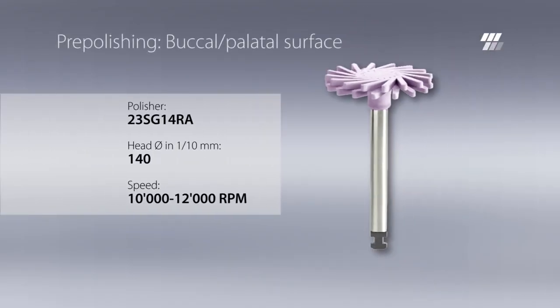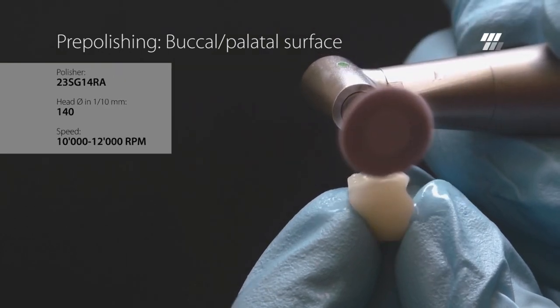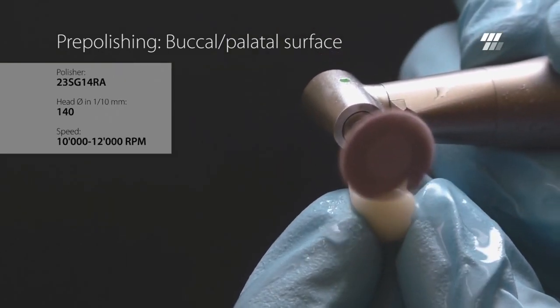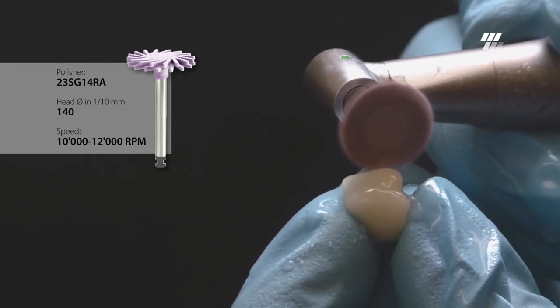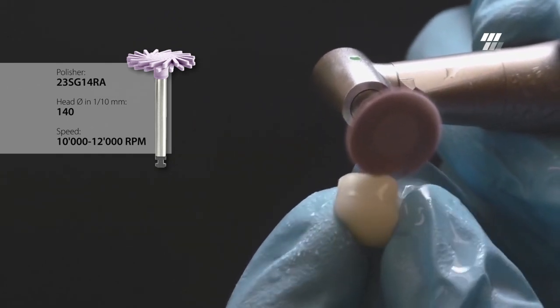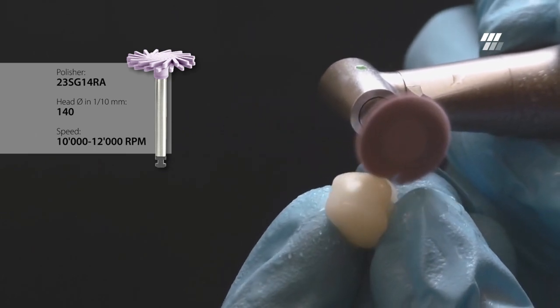Diatek ShapeGuard Purple with a diameter of 14 millimeters is suitable for buccal and palatal surfaces. Although Diatek ShapeGuard is pressure insensitive and gentle to the composite crown, it is recommended to exert minimal and constant pressure.